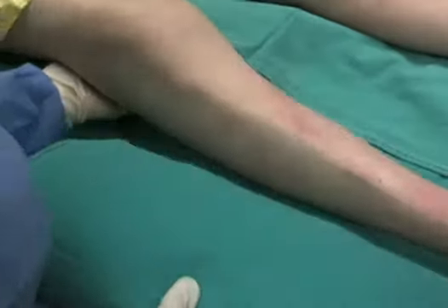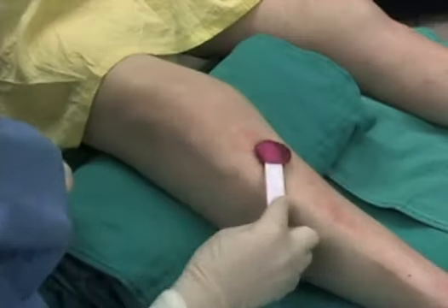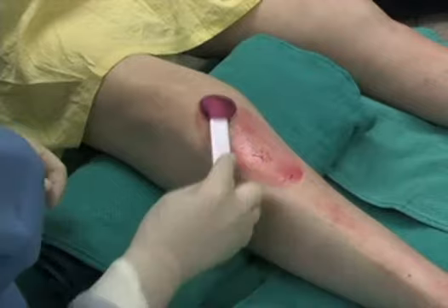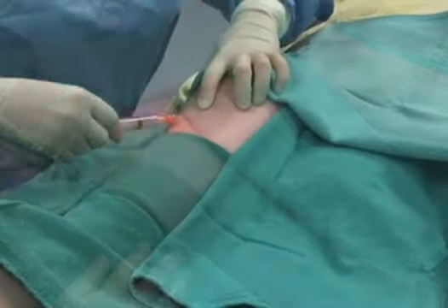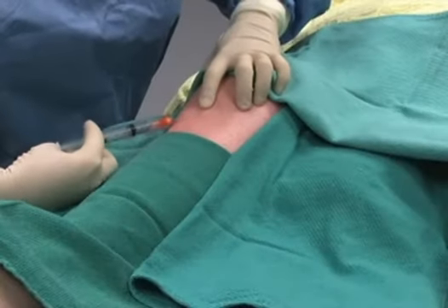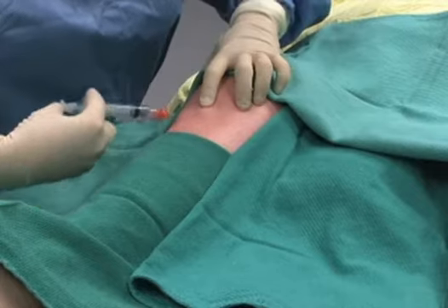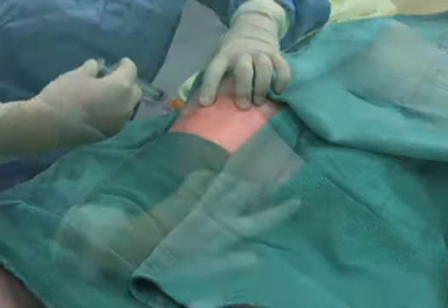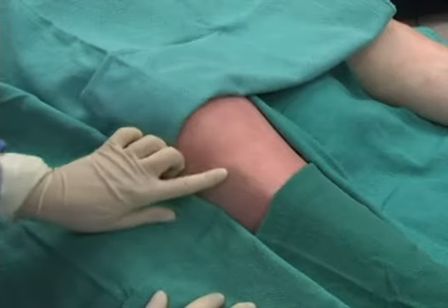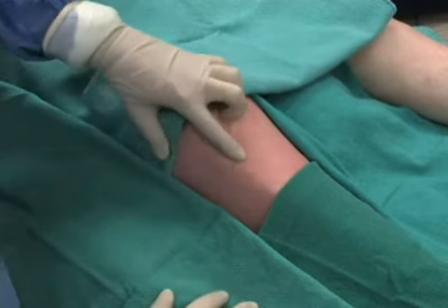Position the patient's leg in slight flexion by placing a rolled towel under the knee. Don sterile gloves and expose and clean the site with chlorhexidine or iodine solution. Then drape the site in a sterile fashion. If the patient is conscious, infiltrate the skin and subcutaneous tissues and the periosteum with 20 to 30 milligrams of 1% lidocaine. Identify the tibial tuberosity. The desired insertion site is the flat medial surface of the tibia, medially 1 finger's width away from the tibial tuberosity.